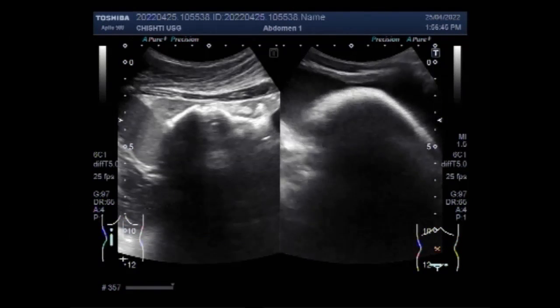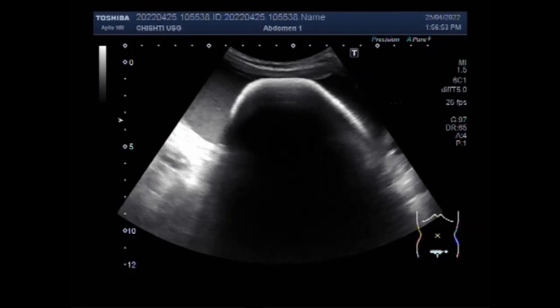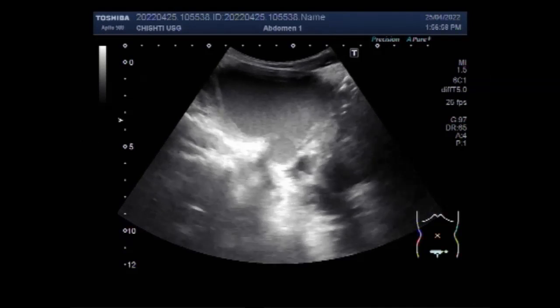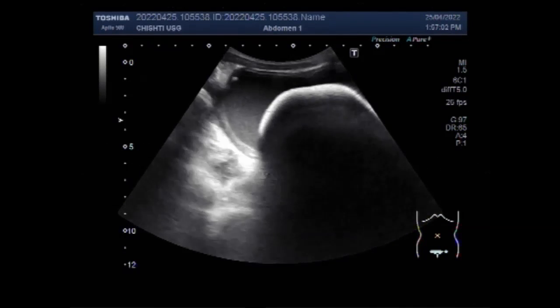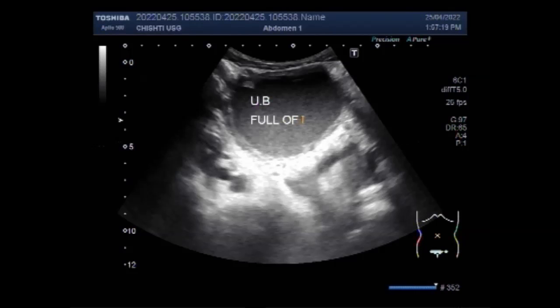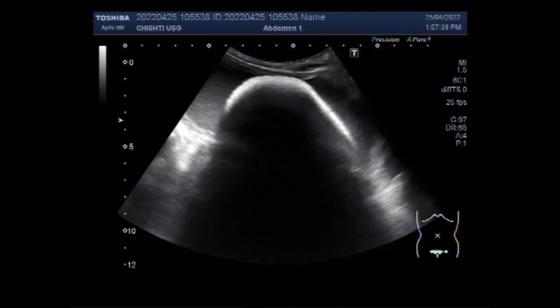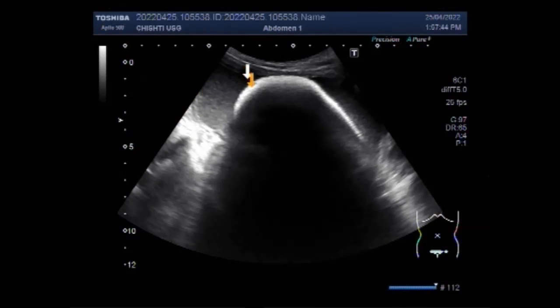Now you can see a large stone in the urinary bladder. I have seen many such large stones many times, but this is one of the largest. You can see the urinary bladder is filled with pus, with multiple thick sludge. The urinary bladder is full of pus, sludge, and a large stone, and a strong posterior acoustic shadow is visible.